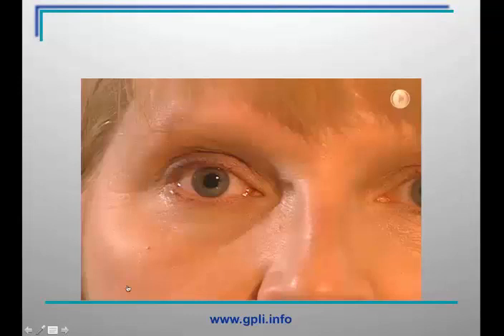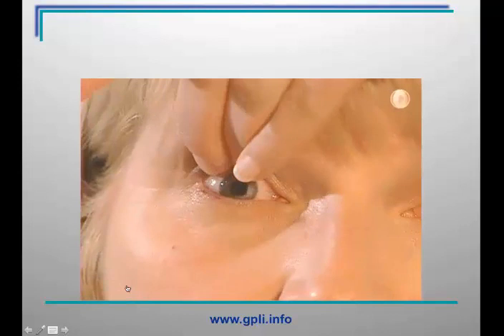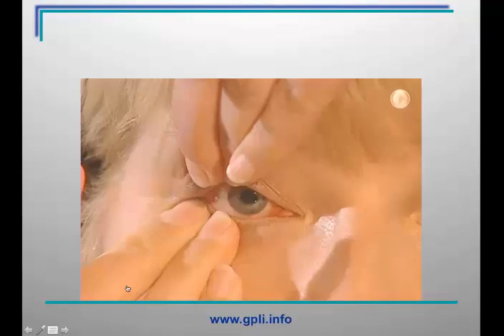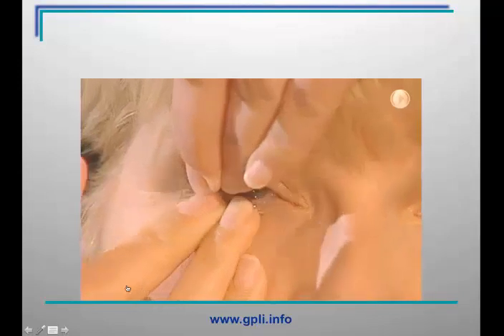Lid retraction is also important when we're considering lens removal. Again, you can bring the other hand up, get underneath the lashes, same hand gets lower lashes, you go laterally or go temporally, that lens can only go one place, that's out of the eye.